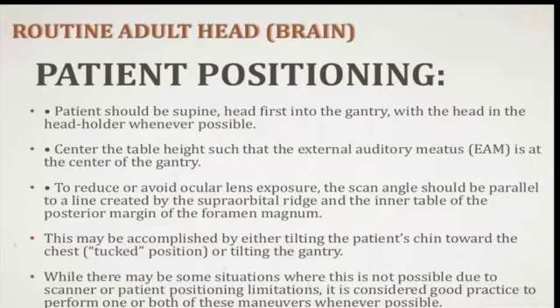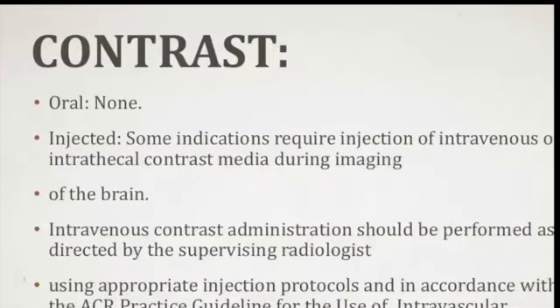So it's from, as I said, the cervical spine C1 to the top of the calvarium, or the top of the skull cap. Concerning the contrast, just please know that there are no indications for an oral contrast, but if you are giving an injected contrast, whether it's an IV or an intrathecal one, these should be done under the supervision of a radiologist. Okay? So that's about it for the pre-phase.